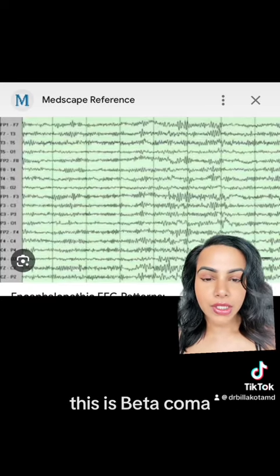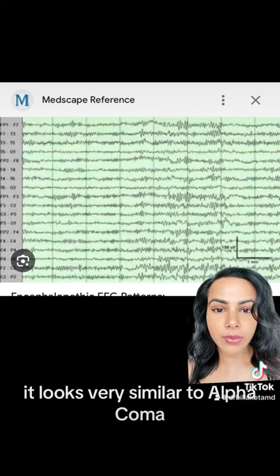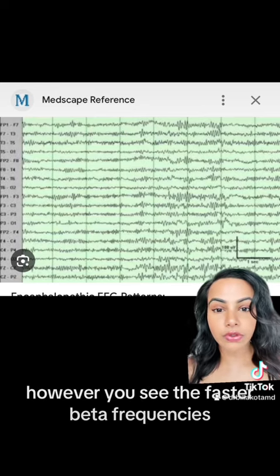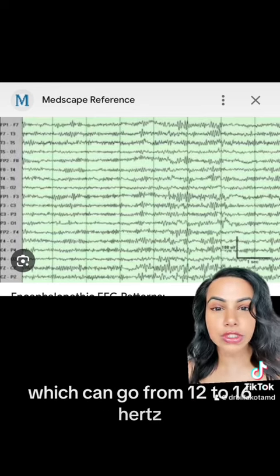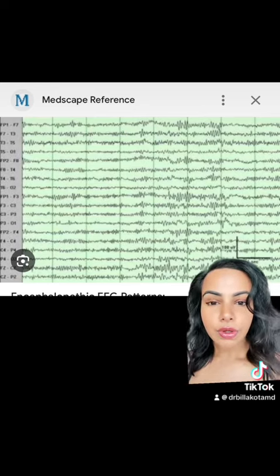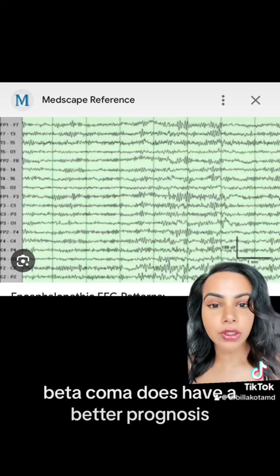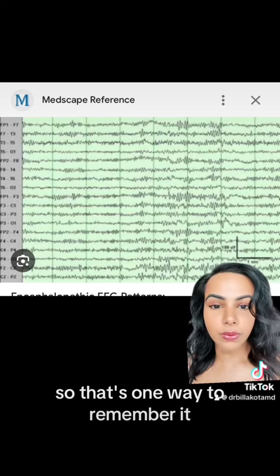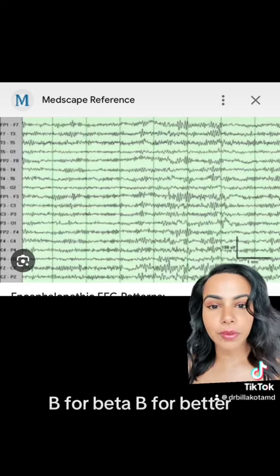Beta coma looks very similar to alpha coma; however, you see faster beta frequencies, which can go from 12 to 16 hertz. Beta coma does have a better prognosis, and that's one way to remember it — B for beta, B for better.